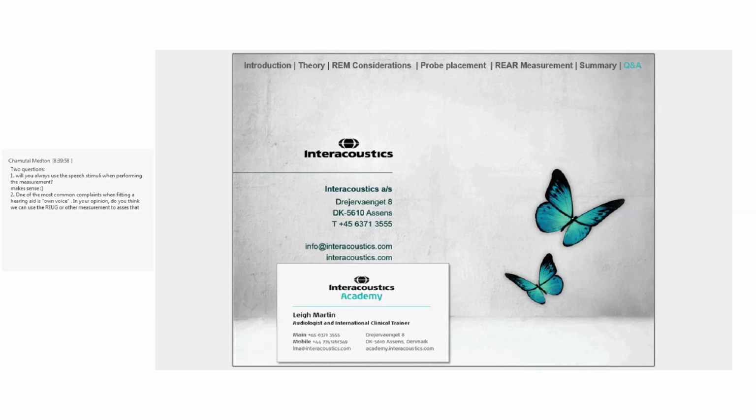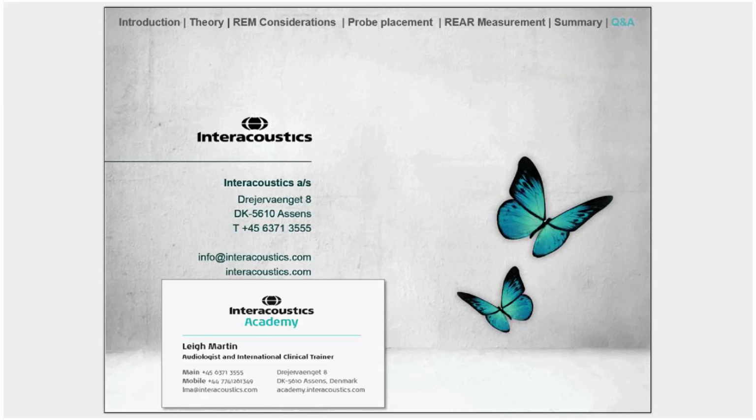That's a good question. What you can actually do is, I wouldn't really use the real ear unaided gain measurement to assess that. One thing you can do is, if you're fitting an open fit hearing aid, you can measure the real ear occluded gain, which is the condition where you have the hearing aid inside the ear but switched off.